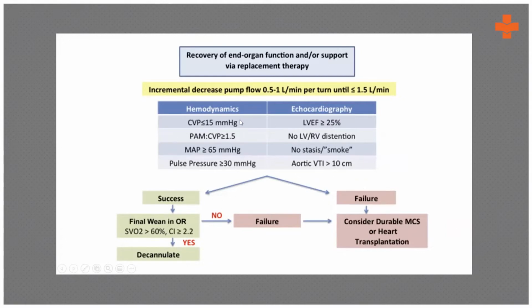That is when you want to try to start decreasing the pump flow incrementally by 0.5 to 1 liters per minute. How we had increased it gradually, the same way we start reducing the pump flow.